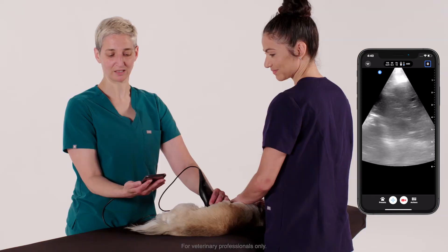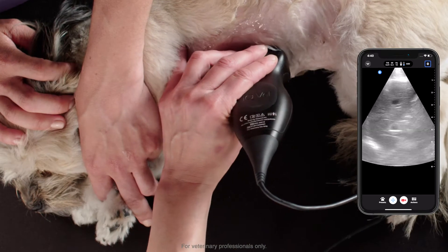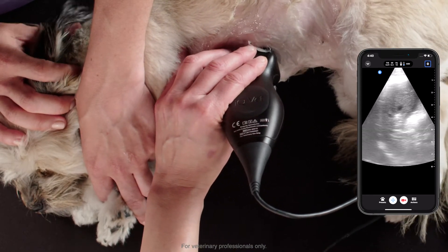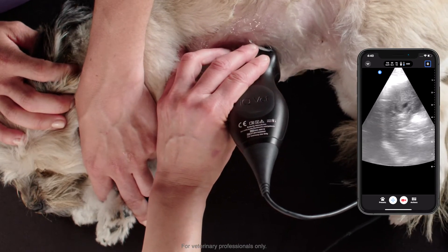We're starting at the liver with the gallbladder in view, which is sort of our home base. We're going to take a quick scan through the liver looking for any evidence of free fluid or effusion between the liver lobes or up against the diaphragm.